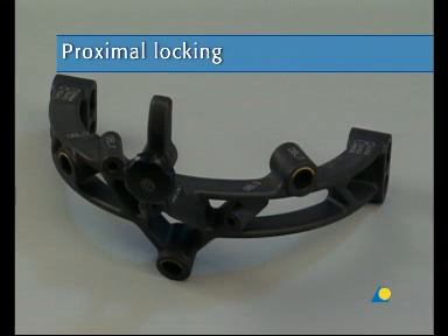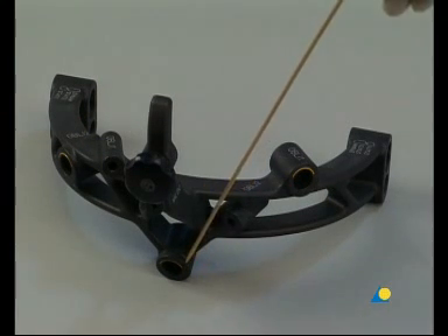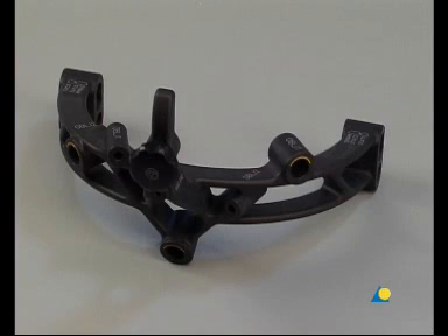The aiming arm can be used for different proximal locking options. These locking options are color-coded on the aiming arm and the corresponding instruments. Three locking options, color-coded yellow, are combined with cancellous bone locking screws for ideal stabilization of the proximal fragment. Two medial lateral locking options, color-coded blue and green, enable primary compression, secondary controlled dynamization, or static medial lateral proximal locking. In this exercise, static medial lateral proximal locking is demonstrated.